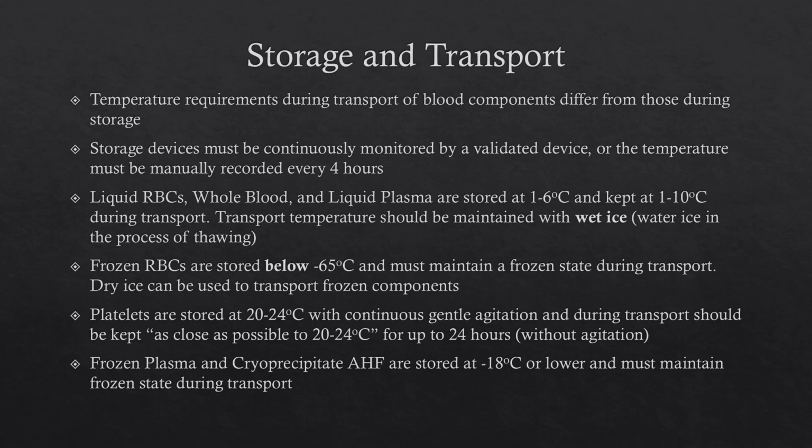That is water ice that's in the process of thawing. You can't take a bag of ice and stick it into a -80 freezer and then pull that out and stick it in a blood box, because you will freeze your blood product. You'll freeze your component solid. It's got to be wet ice that is loose and it's wet to the touch and is in the process of thawing out. That will maintain your storage, or excuse me, your transportation temperature of 1 to 10.